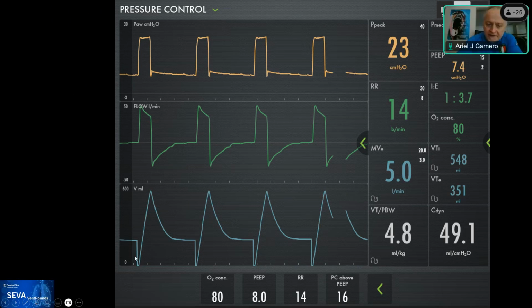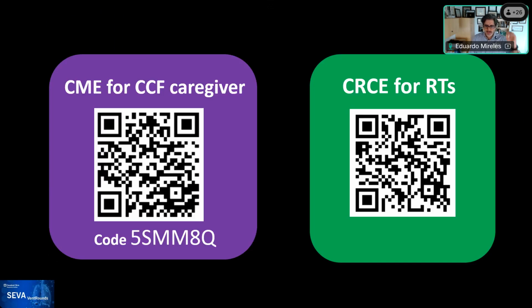In patients that were awake, at my previous workplace, we used to use NAVA due to a massive leak, but they were triggering. This guy at this present time was still heavily sedated or still paralyzed. Yeah. So without a doubt, when you cannot use an airway signal, then other technologies become more efficient in this group of patients, and NAVA may be one of them, although considering there's going to be a very large leak during inspiration and expiration, no doubt. So I'm going to stop there.